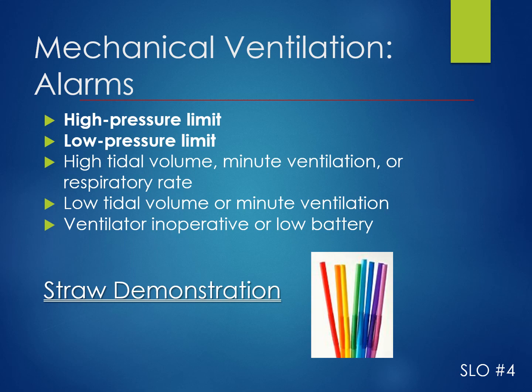So those are really the only two alarms you need to be familiar with. For the rest of these, it's definitely going to be a respiratory therapy situation. So if there's ever a situation where the alarms are going off, or even with a high pressure or low pressure where you've done your interventions, you've checked the tubing for leaks, you've checked for secretions, depending on the alarm, and there's still a problem, then you would contact respiratory therapy to come take a look.